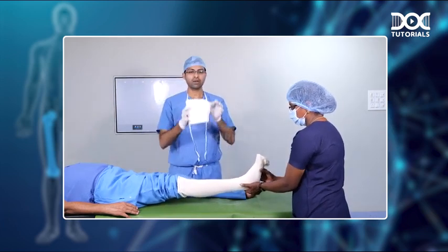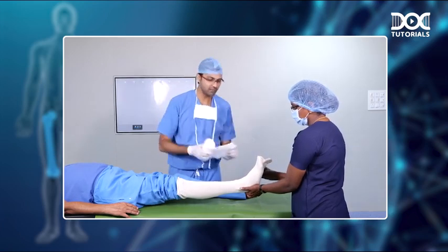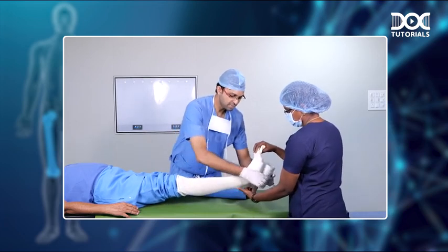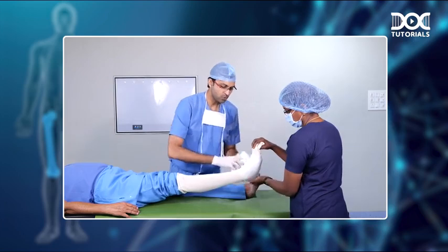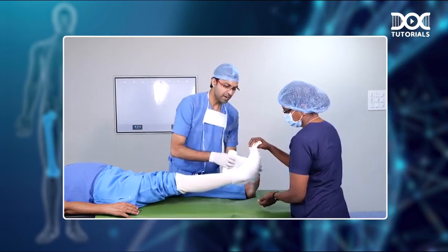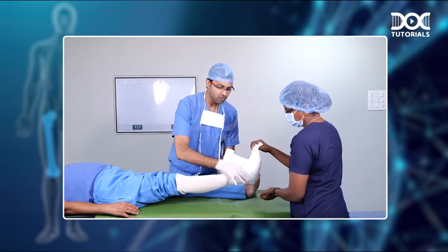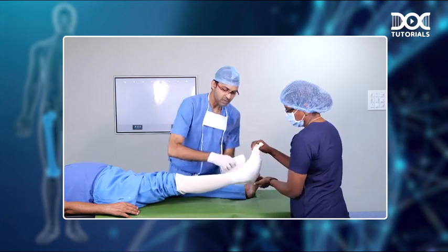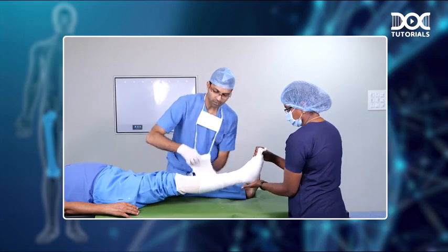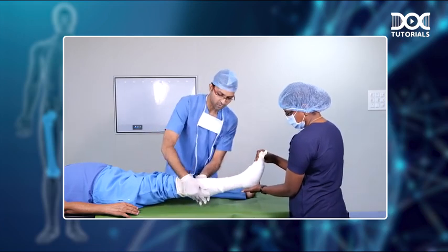Next layer is to apply cotton. This is what we call a soft roll cotton, which is readily available. You start rolling the cotton around the leg like this. From the foot, you have to go proximally. Make sure that you give adequate padding around the ankle, especially around the bony prominences. Your malleoli and all should be well padded. Otherwise, there will be ulcer formation around the bony prominences. So now you have applied your soft roll cotton.